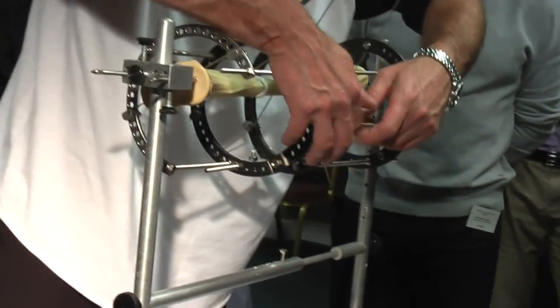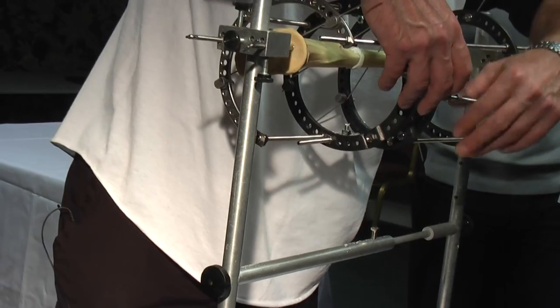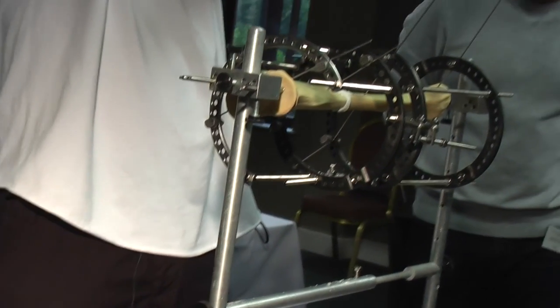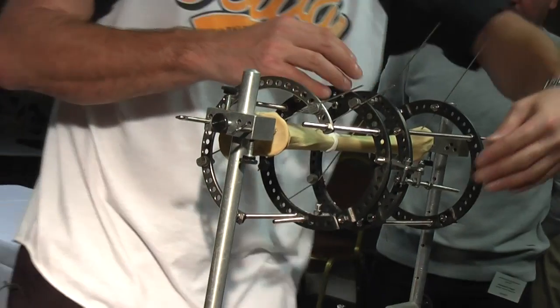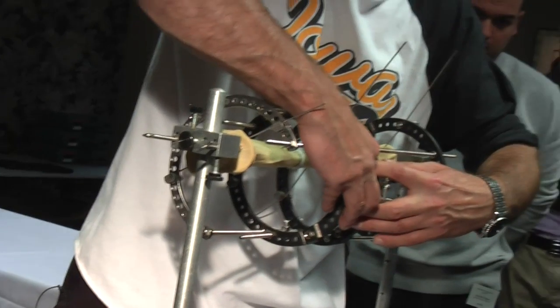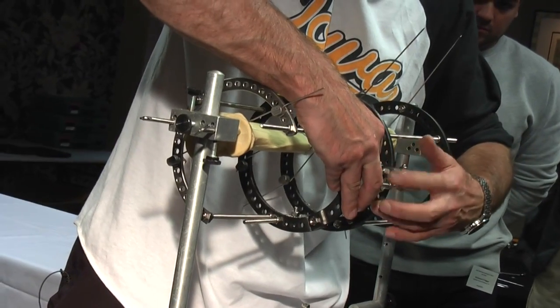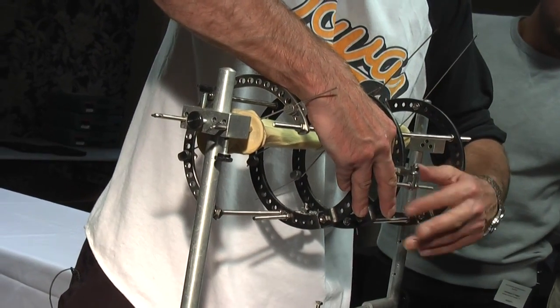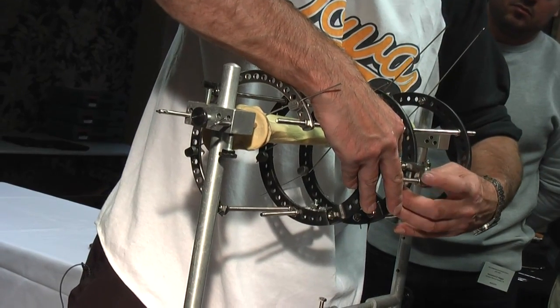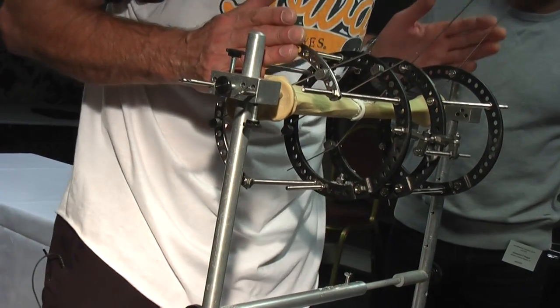Okay? Basically now, if we turn to our motor, that thingy down there, and start to turn it, the frame will try and straighten in that direction that you can't quite see. And in theory, the tibia should then just come out straight, shouldn't it? About parallel, about straight.